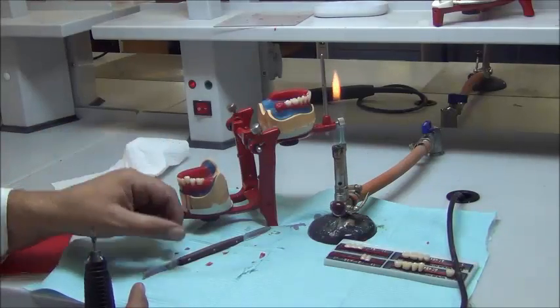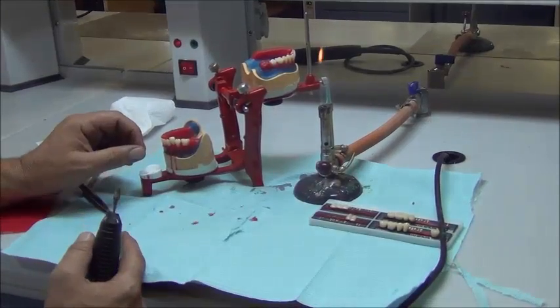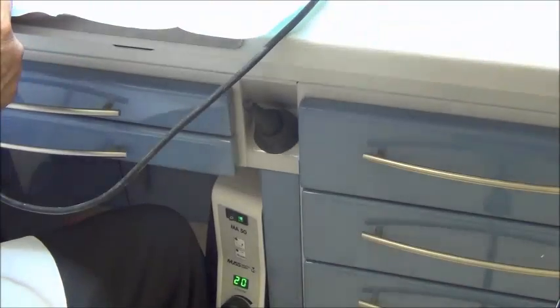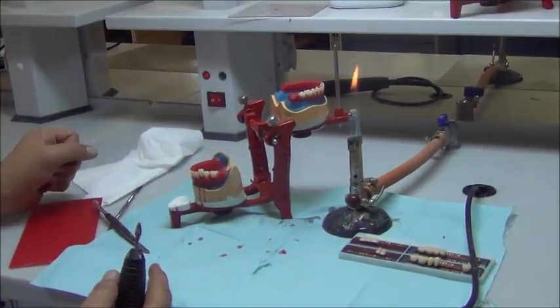So to make the tooth fit, we're going to use a handpiece. We're going to trim using the tungsten carbide bur, and we have adjusted the speed of the unit at 20. We don't want a high speed because we don't want the tooth falling off while we're trimming.